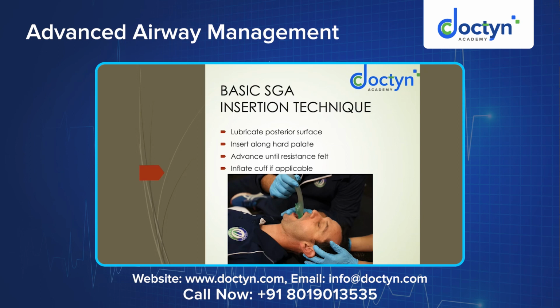Then the laryngeal mask passes through the oropharynx, and there will be some resistance when it sits on the larynx. So you lubricate the posterior surface, insert along the hard palate, and pressurize against the hard palate. Once the hard palate is crossed, you will get a giveaway. Then you insert further. There will be further resistance when the laryngeal mask airway reaches your vocal cords. Till then you will be inserting.